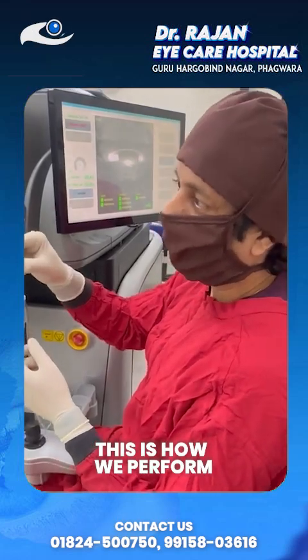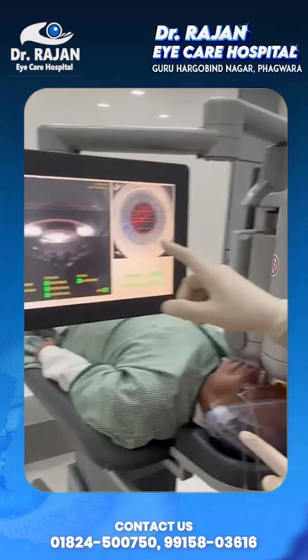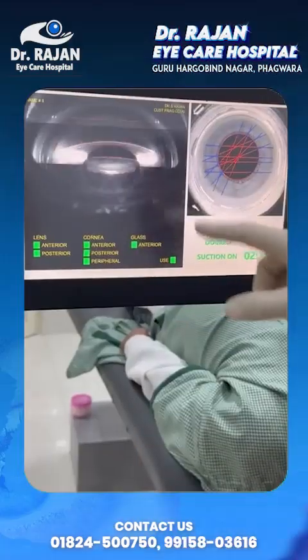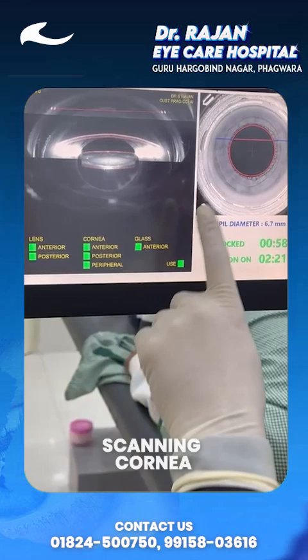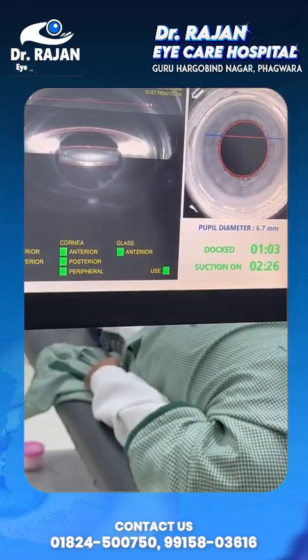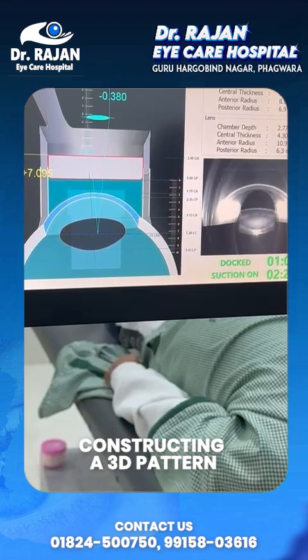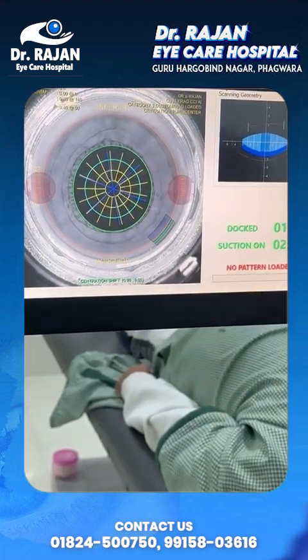Done with the manual blade. Now you can see all of these things we are going to do with the laser only. We are doing the laser scan of the cornea and lens, and now we are constructing this 3D reconstruction and a pattern that we're going to use for the surgery.